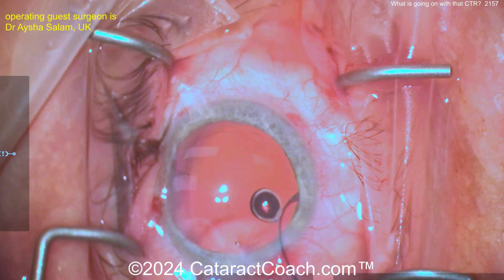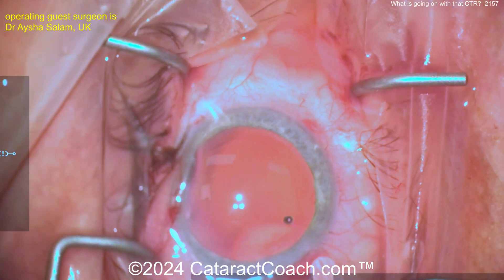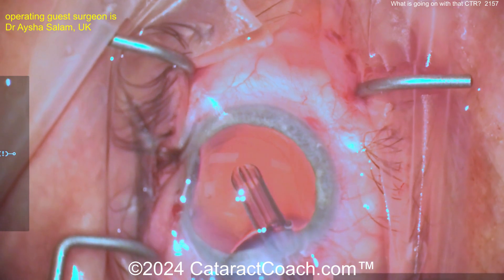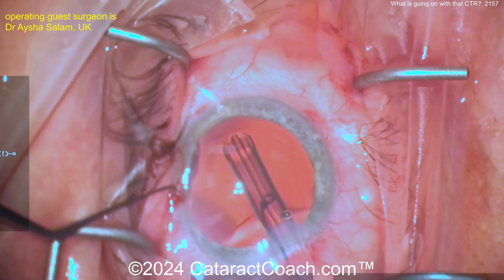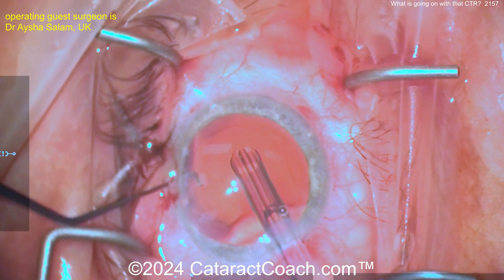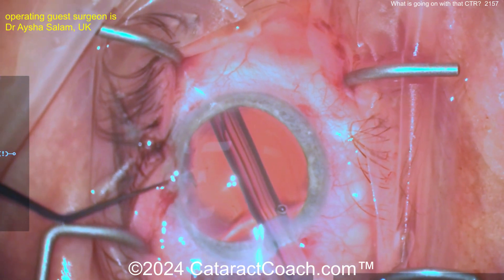You need to come out of the eye here and put it in a different way. Going in yet another time — aim it towards the left side of the screen, left, left, left, left. Or you can use my technique — stay tuned, I'm going to show you two easier ways to implant a CTR coming up in just a minute.